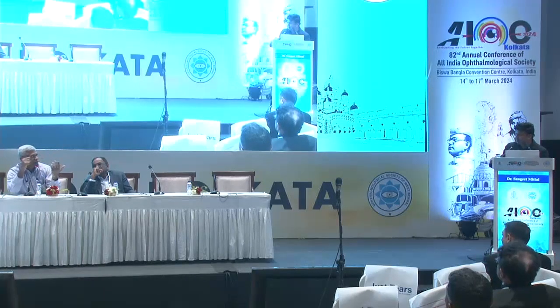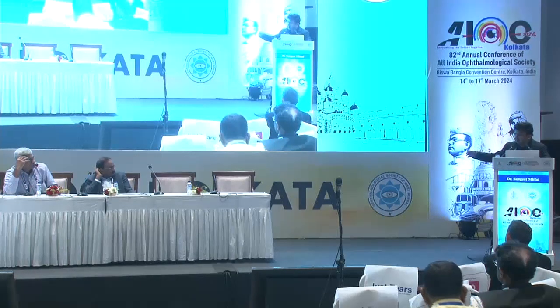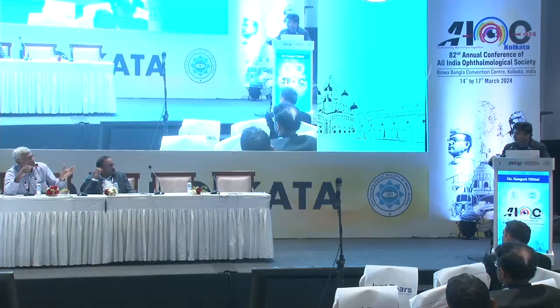So from the cutter it comes, goes inside on one port, and from the other port it goes to the cassette. Sir, in that situation, will suction build up? Because this is enclosed, you're putting a bottle in between this and this, that's all, and it's a watertight one. I'm saying the bottle is here in between the cutter and the machine. That way your cassette will also not get contaminated. Everything will go directly into the bottle.